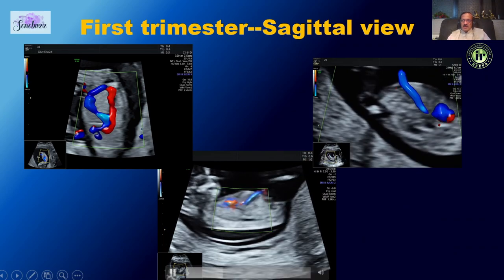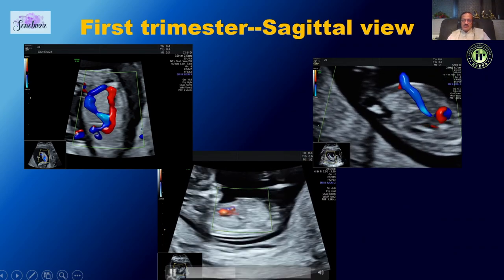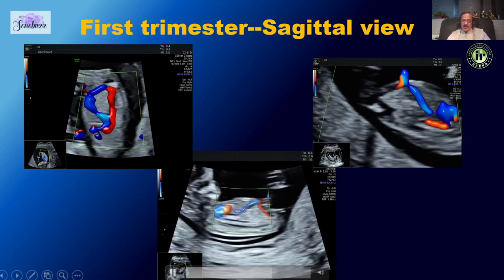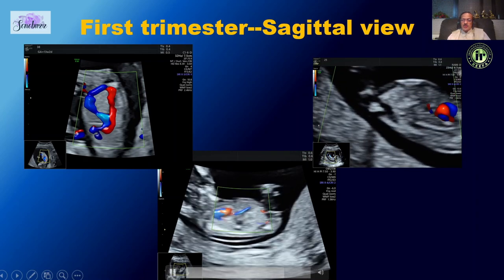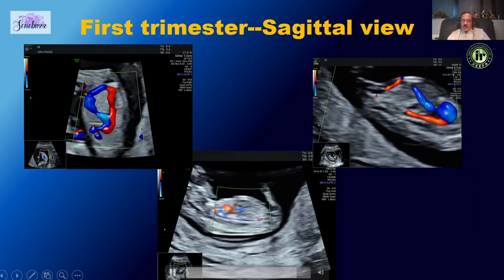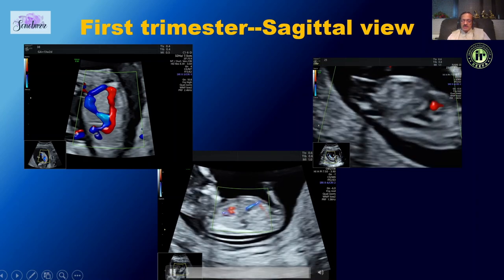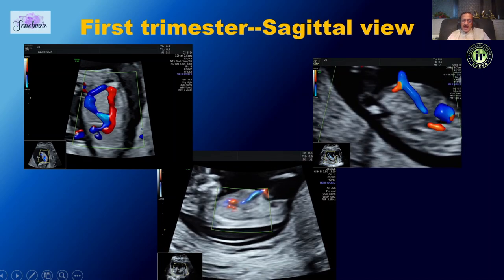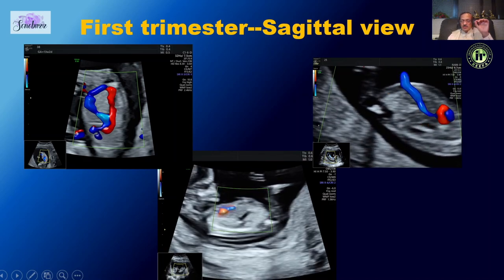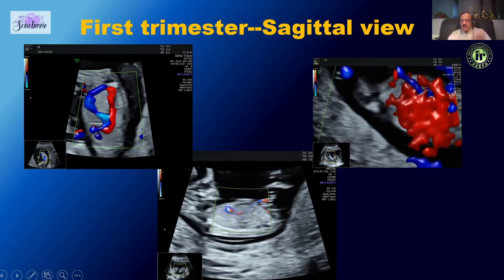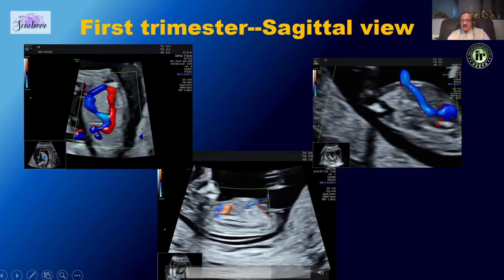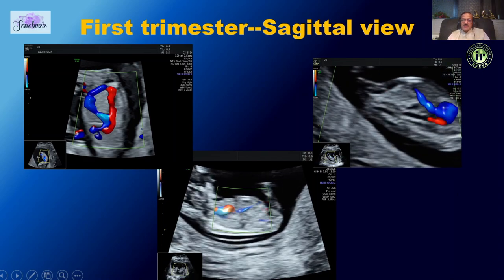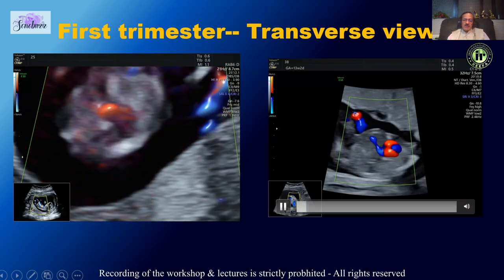The ductus venosus can be assessed in both the sagittal plane and the transverse plane. Here are three examples of the sagittal plane. It is easy to identify because it is the area where the umbilical vein suddenly becomes narrow — it forms a small triangle — and importantly at that point you see aliasing due to high velocities.